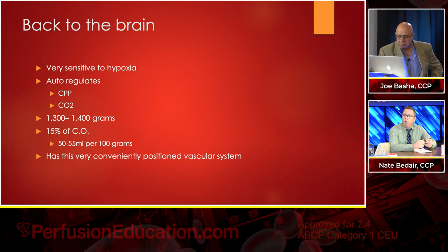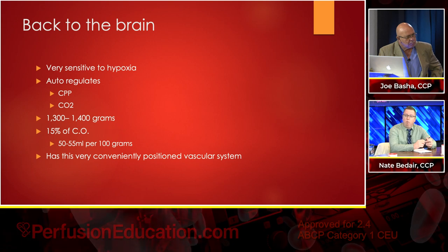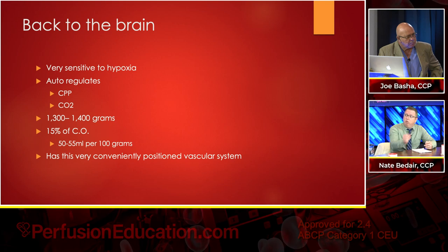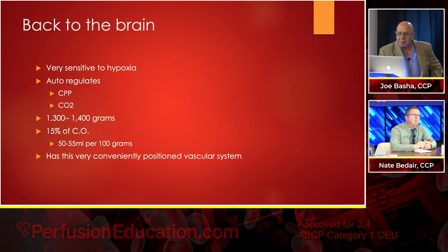So I've got my water temp cranked. There's another way to do it. Otherwise, at the end, they're sitting there waiting on me, looking at me going, did you start rewarm when I said rewarm? But I told you, or asked you, 10 minutes before, for a reason. Anyways, yeah. Sorry. We probably shouldn't do that.